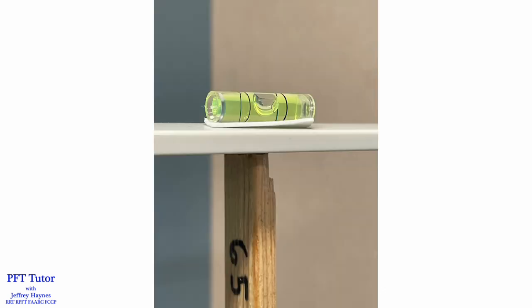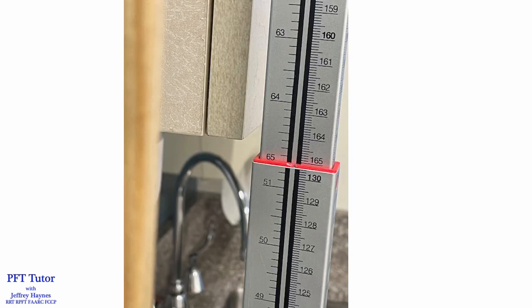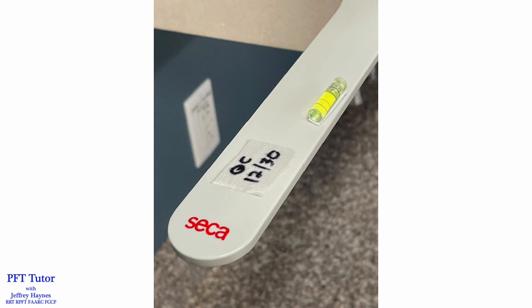Stadiometers are becoming more sophisticated. There are digital types now. In our lab, we have more basic stadiometers. So I put this little level on the headpiece to make sure that it's level, both when I'm making a measurement with a patient and also testing it for quality control. As I said, our measuring stick is 165 centimeters, and you can see here that the stadiometer is pretty much spot on. Then I just add a little label to the headpiece showing when the last time it was checked, and that can also help with a patient who's questioning it. I can say, well, I just tested it 2 days ago.